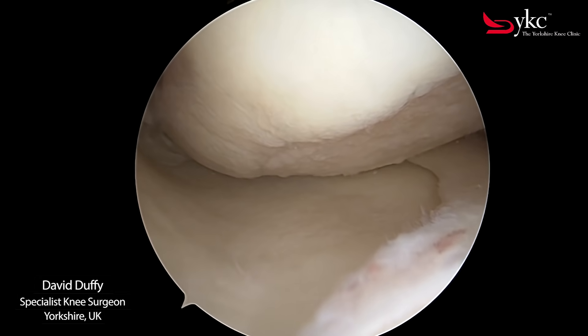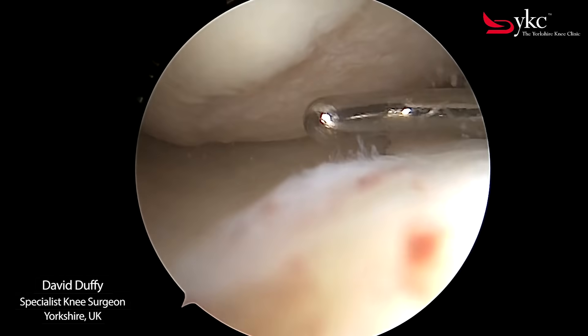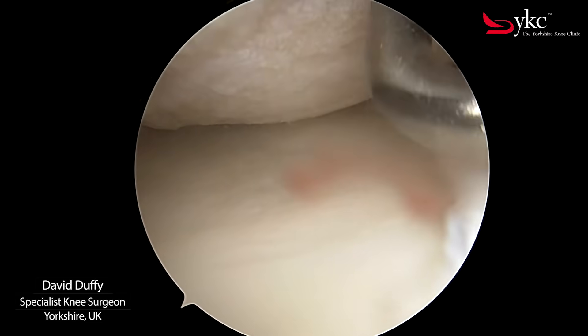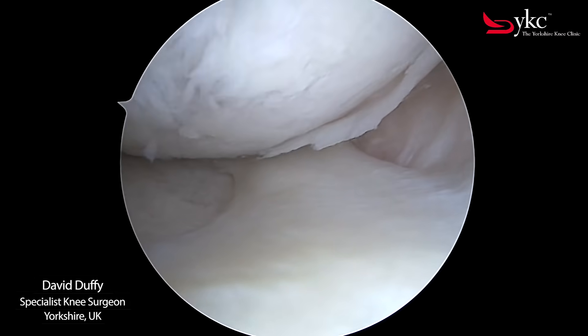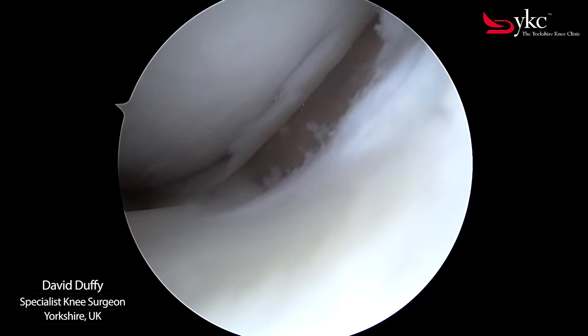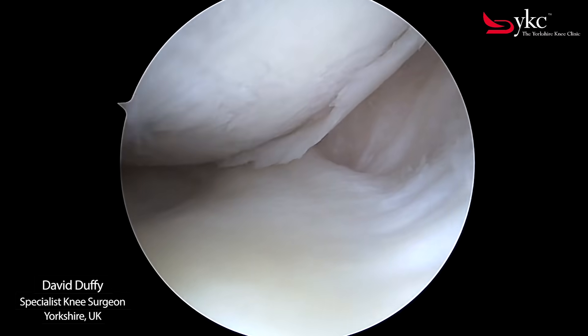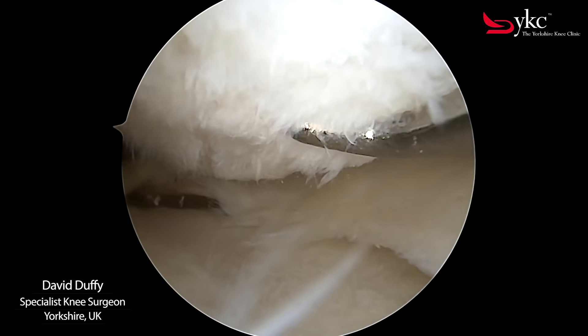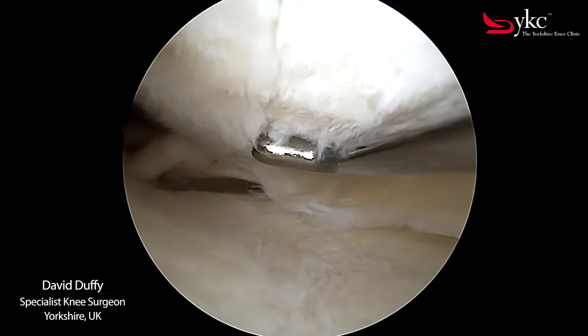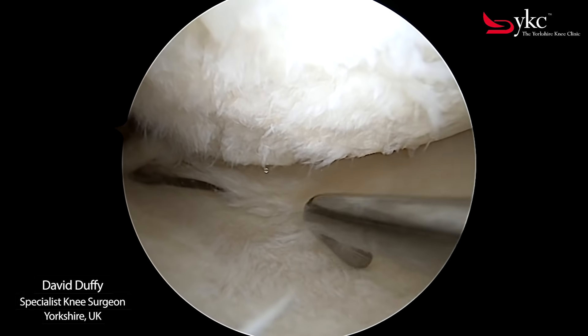As the joint begins to wear you see areas where the cartilage has become thinner, as demonstrated here with the probe. Loose fragments can be seen here and these can catch, causing pain and discomfort to the patient. The once smooth and polished surface of the articular cartilage is now developing an irregular and roughened appearance, as shown here.